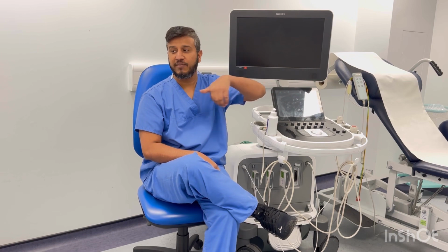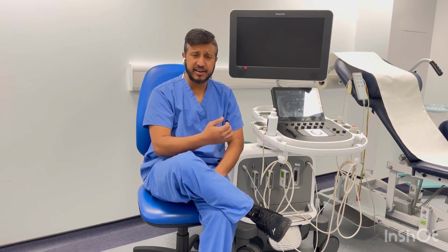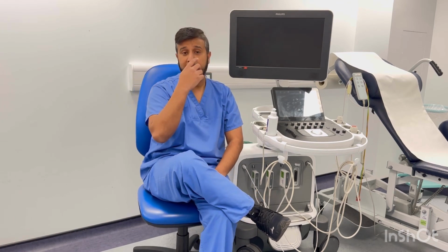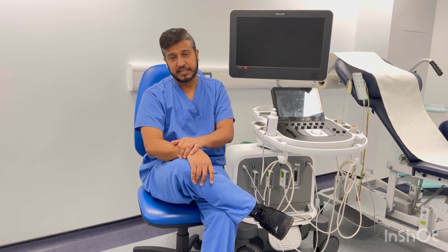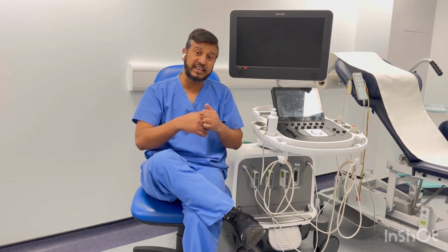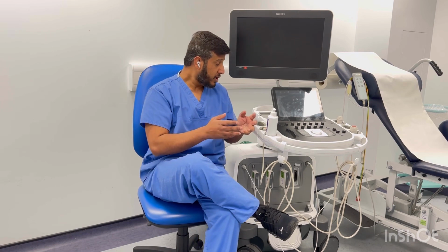In the same way, if you have an adult patient who is very obese and you are using an adult probe and not getting the best images, try to decrease the frequency. There are options on the machine to decrease the frequency. I'll show you later on. I'll tell you about the knobology of this machine, and also the GE ones when I'll be working on them, and I'll show you how you can decrease the frequency of the probe, to increase your depth and get better images.